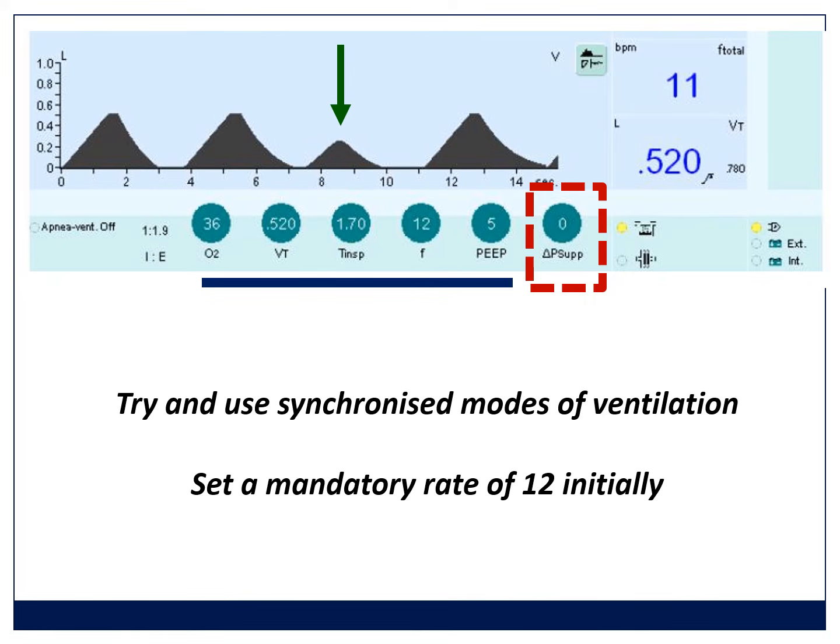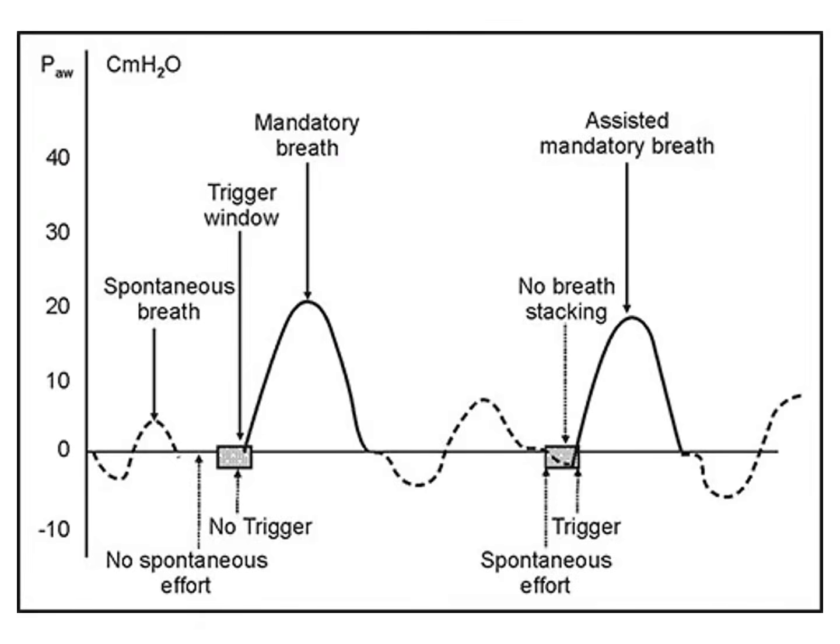And often if you're doing anesthesia where paralysis is needed, you can use this mode. And then once they're breathing nicely, you can turn off the mandatory breaths and just let them have supported respiration. It's a nice way to do anesthesia.